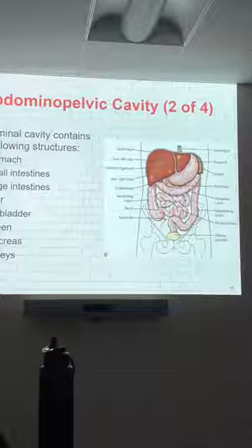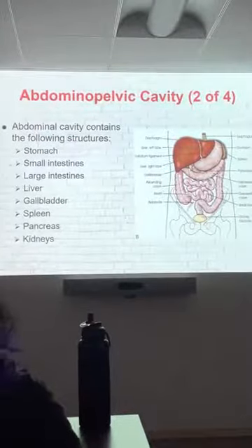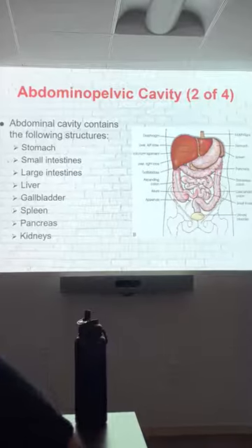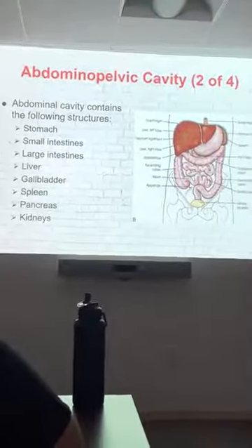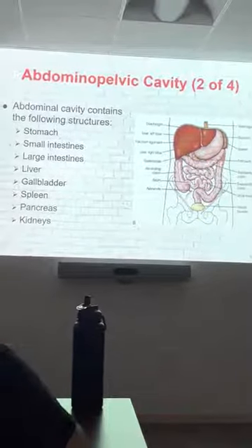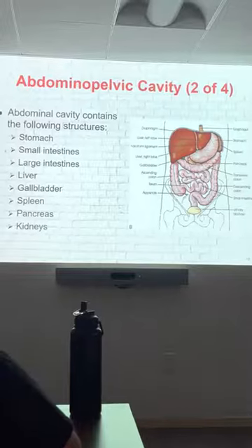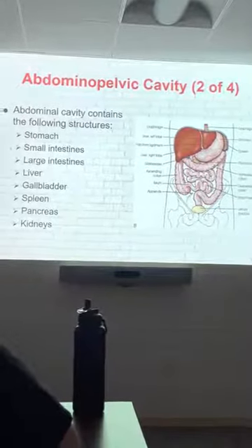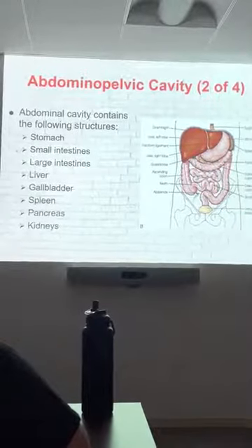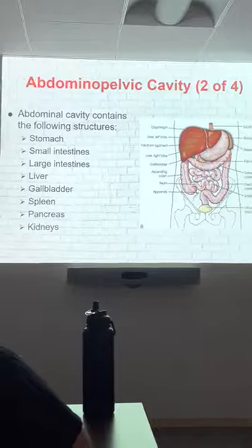Now, as you look here, you can see there's a lot of little labeling on those intestines. Do I need to know all these? Yes, you do. We're going to look at those closer moving forward. Intestines specifically. Liver we're not so concerned with right now. We're going to come back to that in Rad Pro 4. Stomach and spleen we're also going to come back to in Rad Pro 4. We're going to focus on our large and small intestines because we can see those specific parts on most of our KUB radiographs if there's air or contrast in the patient's organs.